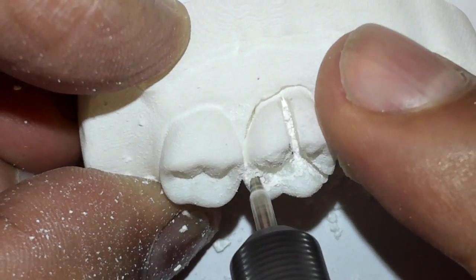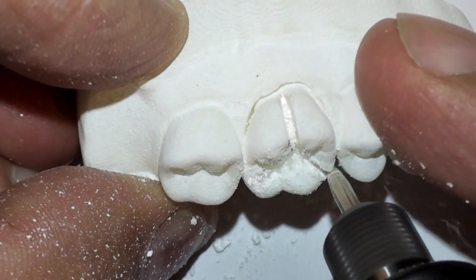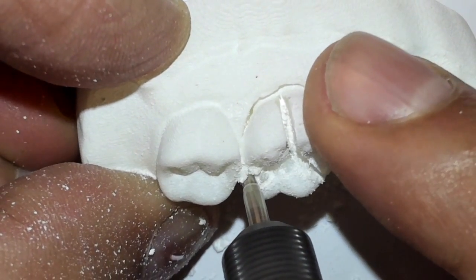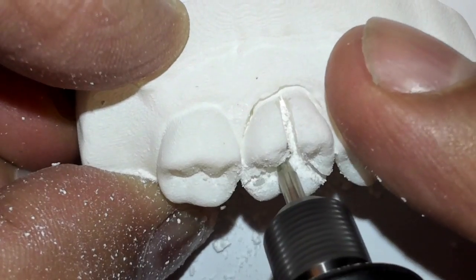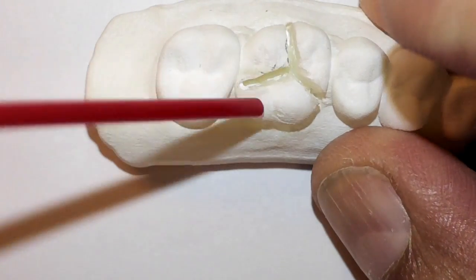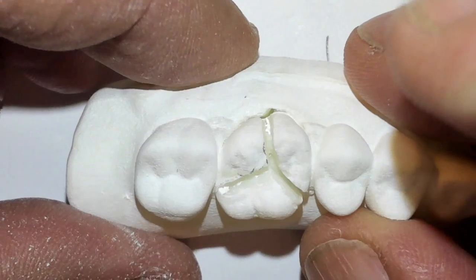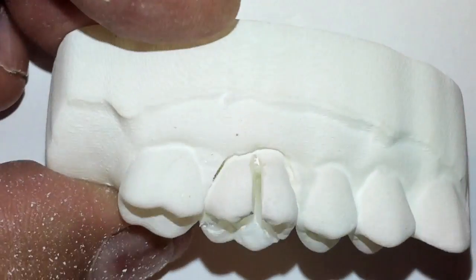You have to think you're going to go in there — it might be 12 millimeters by the time you reach the CEJ. And you want to definitely go past the cemento-enamel junction. Getting there — let's go deeper.